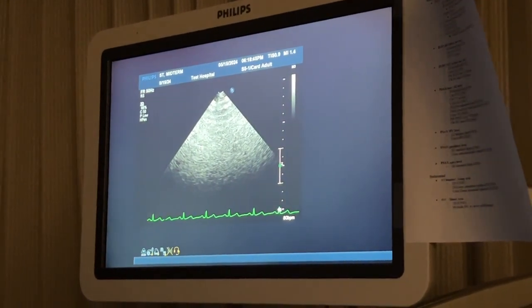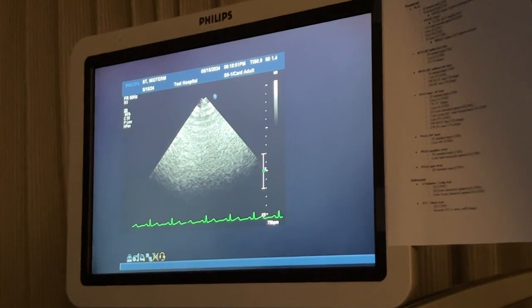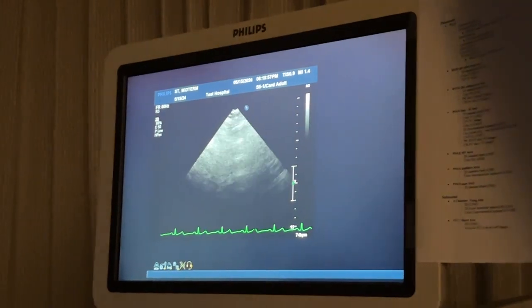You do the midterm protocol? Yeah. So see what you can notice, the differences, before I even talk about it. Once we finish the video, since you guys can study that separately, then we'll look at some fun stuff. Okay? So I'll start out in the middle of your chest right here.